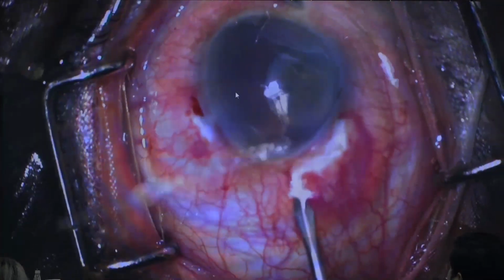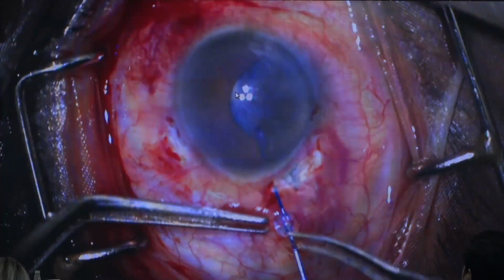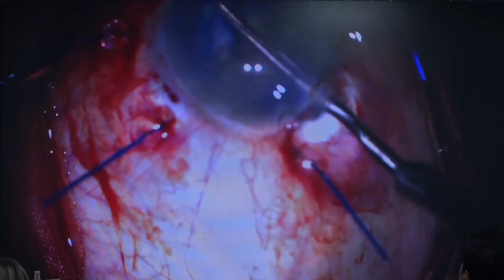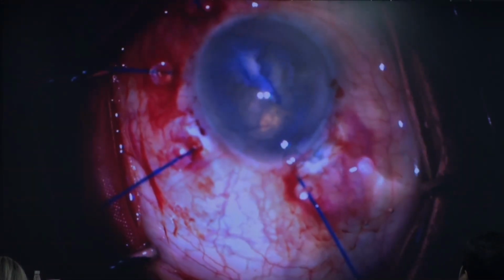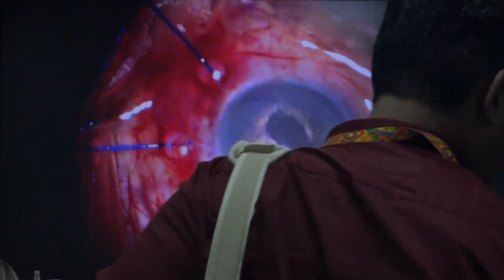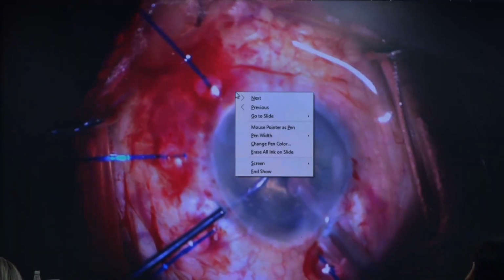Yeah. So this is one of my cases during my residency, and I'm following more or less the standard guidelines. You make a scleral tunnel, you make a posterior limbal incision. I am doing a rhexis in a fibrosed capsule. I can't complete it, so I trim it with a micro scissor, create a complete rhexis, and then I go ahead.